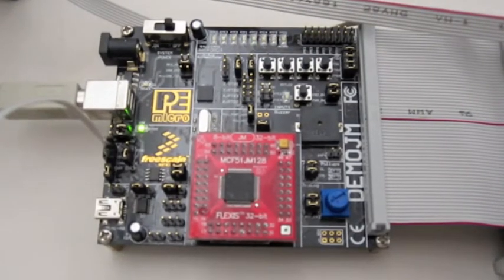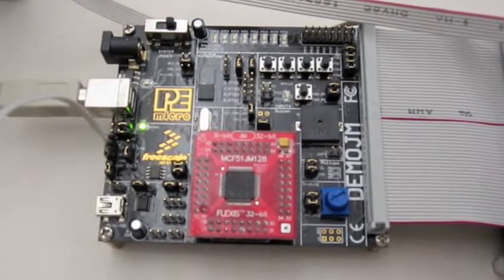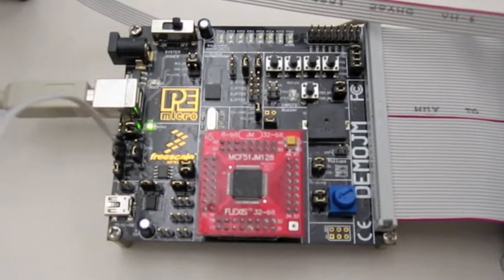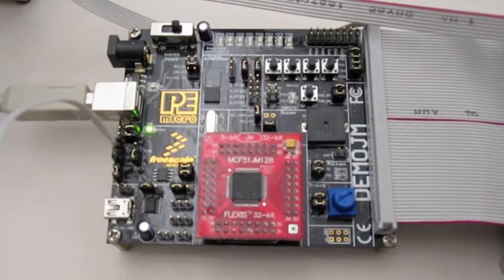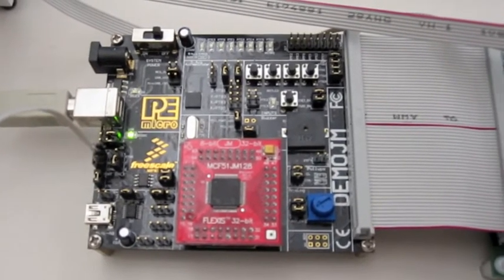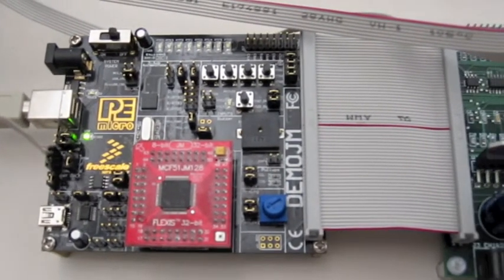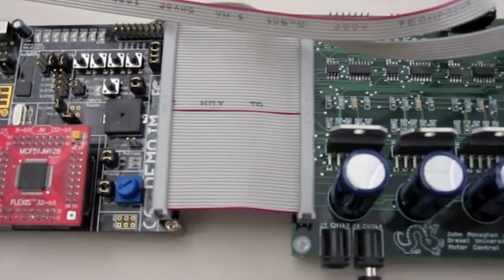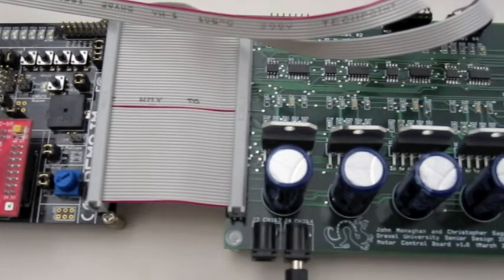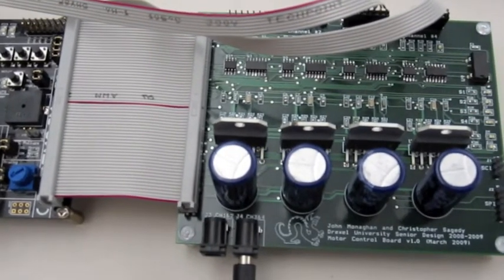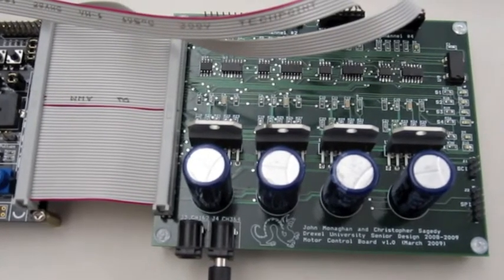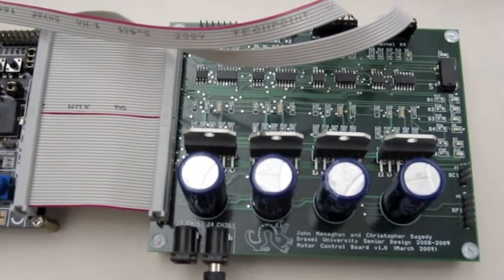Two microcontrollers are used to execute the control algorithms necessary to provide force feedback and to control the endo-wrist. We selected the Freescale ColdFire MCF51JM microcontroller for its onboard USB functionality, which allows data to be sent to a computer to be plotted in real time. We also designed a circuit board that includes all of the electronics necessary to control the DC motors. Each board is capable of controlling up to four motors and interfaces directly with the DemoJM demonstration board.